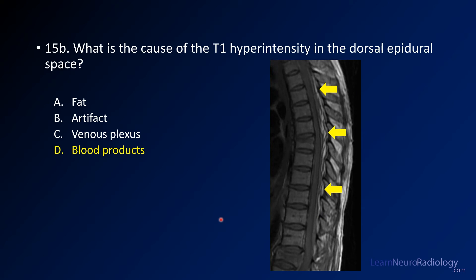That T1 hyperintensity in the epidural space is due to blood products, which are T1 hyperintense. There's not a lot that can be T1 hyperintense — you can get artifacts and CSF flow, and venous plexus, although that tends to be more common on the ventral side. But here, the dreaded thing you have to worry about is blood products.